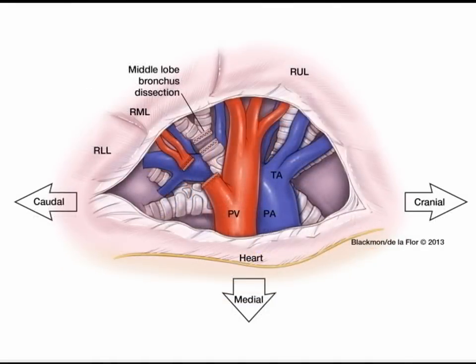Once the pulmonary vein branches have been divided, you should encounter the bronchus going to the right middle lobe. This structure is then encircled, stapled, and divided using a bronchial staple load — with Covidien, a purple load; or with Ethicon, a blue or green load, typically a blue load.